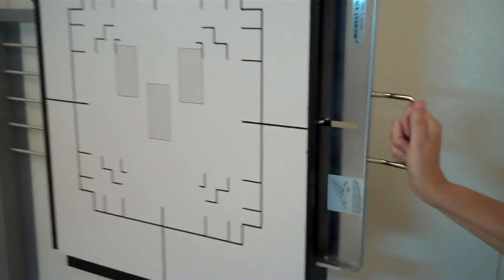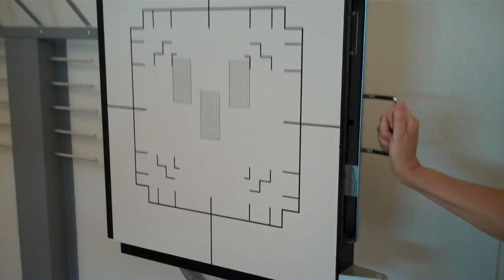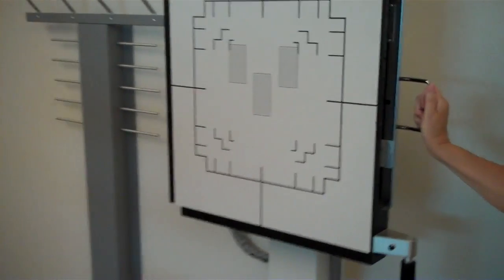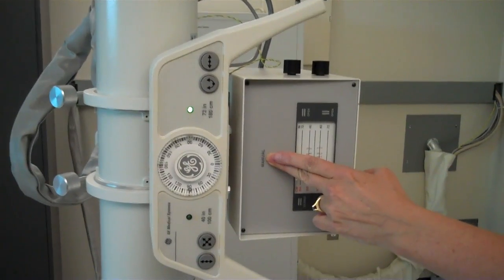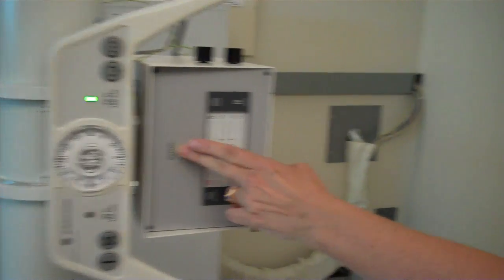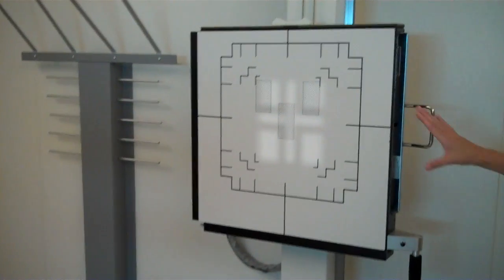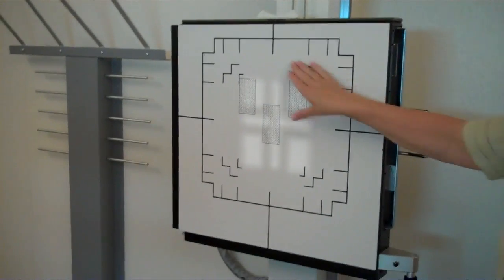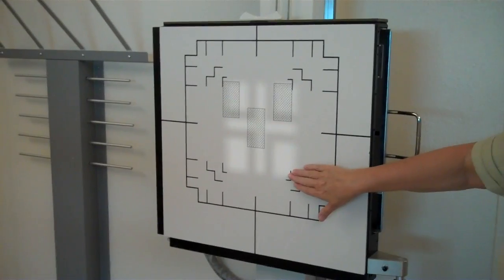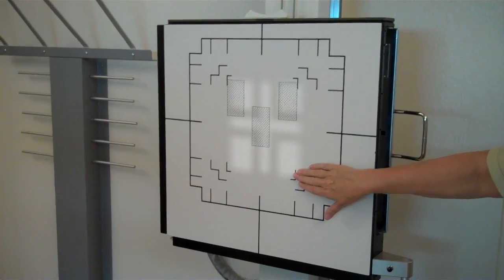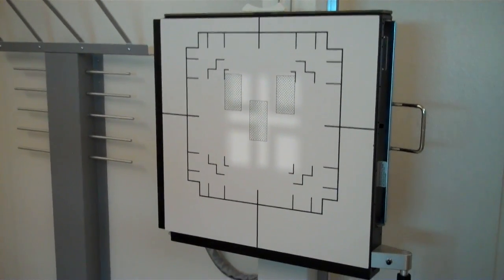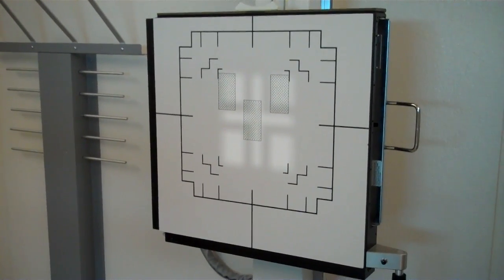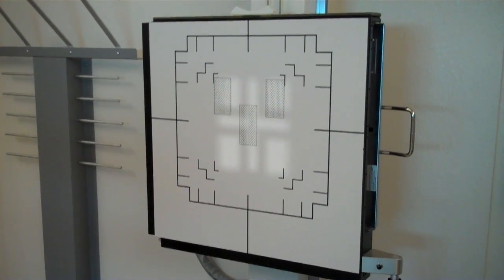Place the image receptor all the way in. Activate the light. And you will see that you now have your image receptor and your tube in alignment at 72 inches.